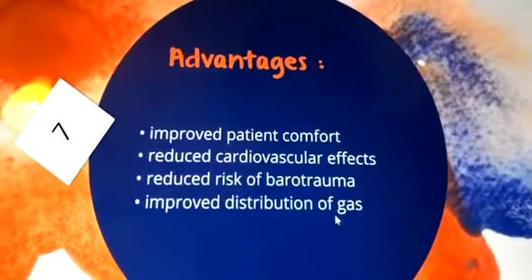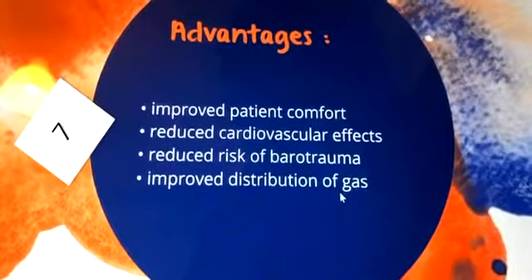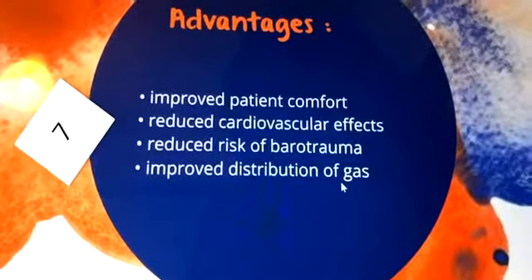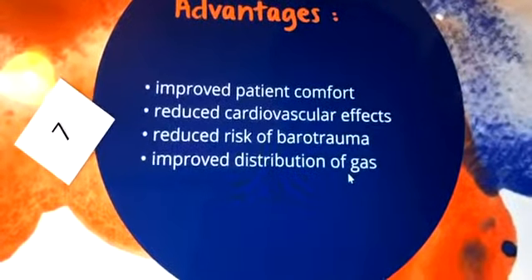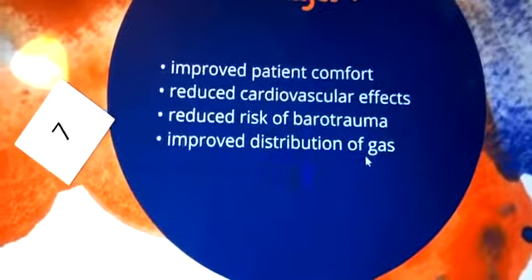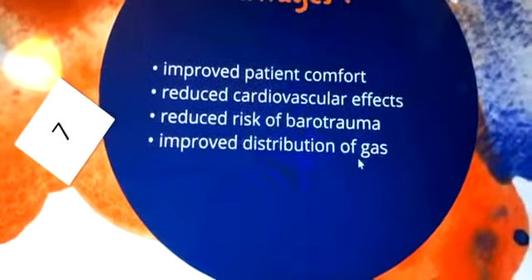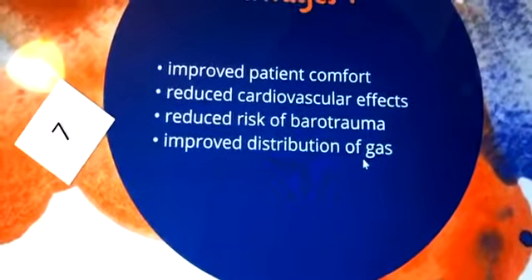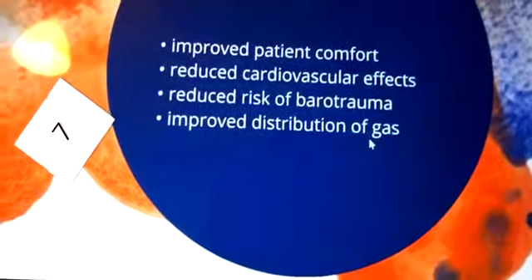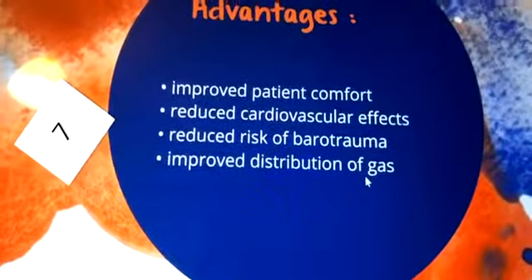The advantages of pressure support. One, it could improve the patient comfort by decreasing the work of breathing mainly. It is proportional to the pressure support we set in the ventilator. يعني أنا لما أعطي pressure support 5 مو نفس لما أعطي pressure support of 10. And I can see the changes in tidal volume.